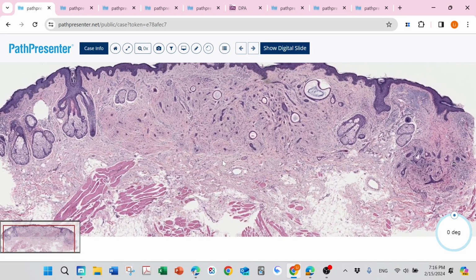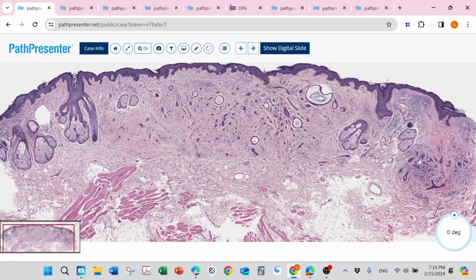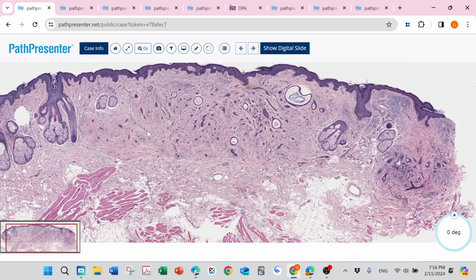But even like this, if you have this lesion, you still want to take it out, because usually it's a broad shape and it's not easy to tell them apart. So this one is just for your information: desmoplastic trichoepithelioma is not similar to trichoepithelioma.